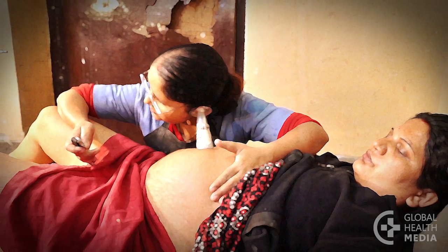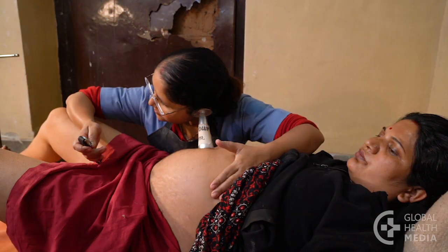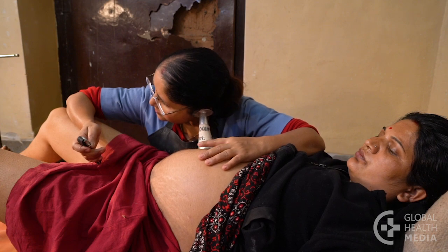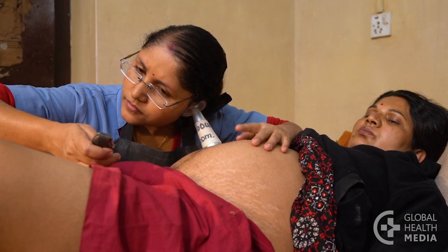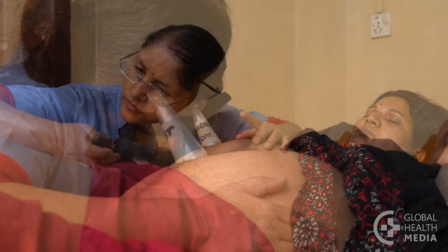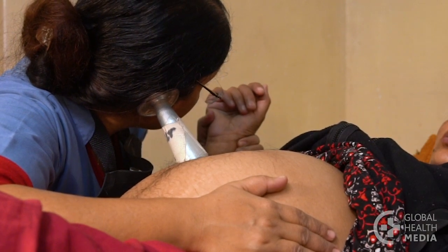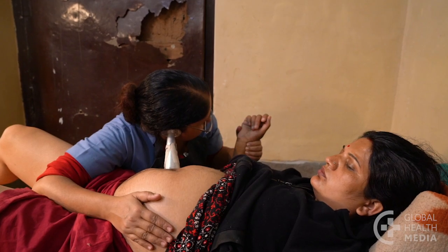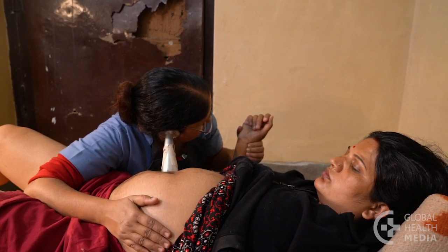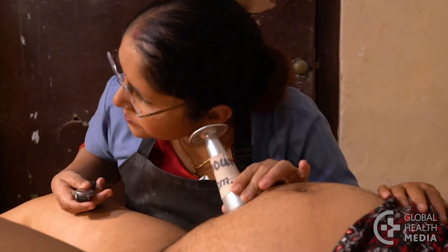How to decide whether the heart rate is normal. The baby's heartbeat is about twice as fast as an adult's heartbeat. If the heartbeat seems very slow, feel the woman's pulse in her wrist while you listen. If the woman's pulse and the heartbeat you hear are the same, you are hearing the woman's heartbeat by mistake. Try another area of her abdomen.